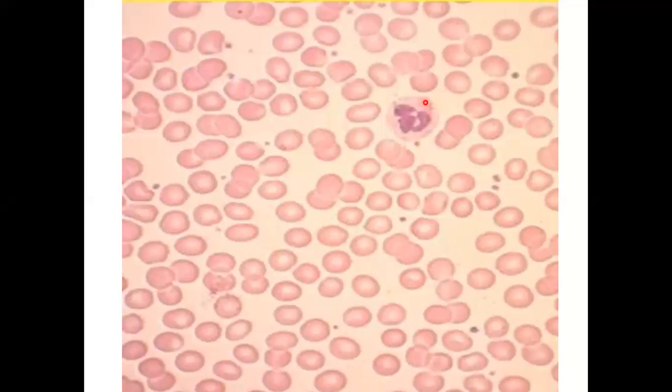The white blood cells are of different types. Like this one is a white blood cell. White blood cells are known as white corpuscles. Then we have smaller ones, these minute cells here. These are platelets. They're usually in clusters. They appear together; they like clumping together. So now let's begin to break down blood one by one. Let's begin with red blood cells.